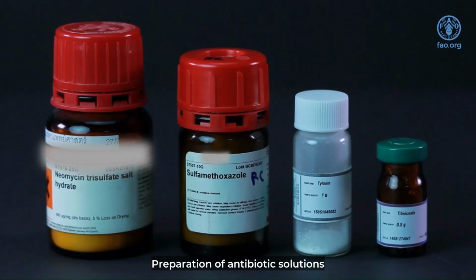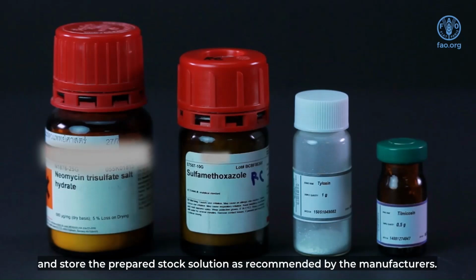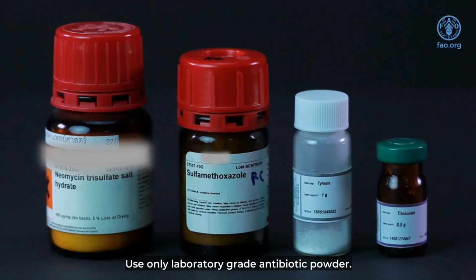Preparation of antibiotic solutions. When preparing antimicrobial stock solution, do not use pharmacy stock or other clinical preparation, and store the prepared stock solution as recommended by the manufacturers. Use only laboratory-grade antibiotic powder.